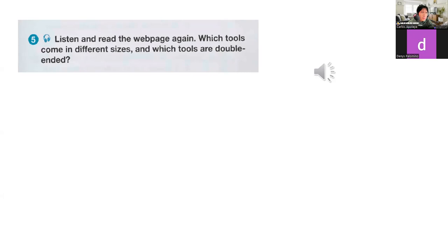The retractor. Yeah, the retractor, of course, because every mouth is different, right? So you use, but I have a question. Do you use a different one depending on the patient? We have different ones for children and for adults. Adults have small, medium, and large sizes. Okay, that's cool. You have the retractor, the curettes, and which tools are double-ended?